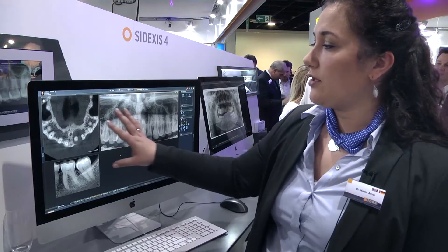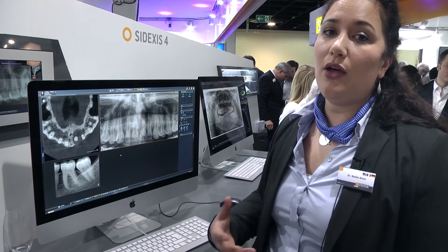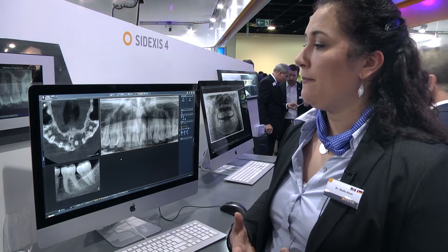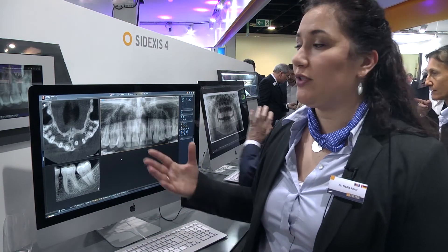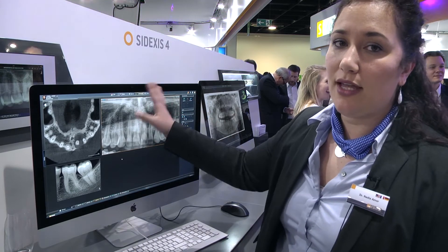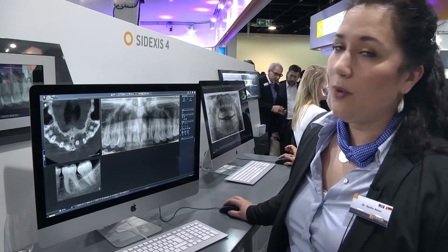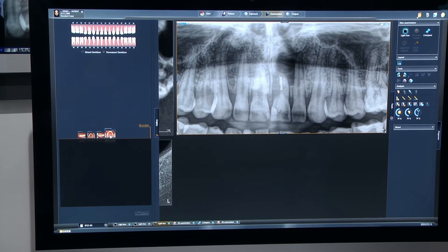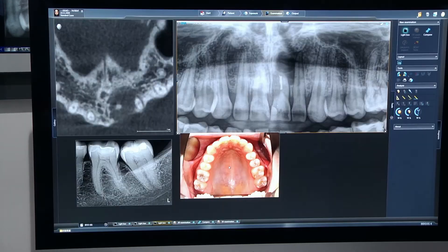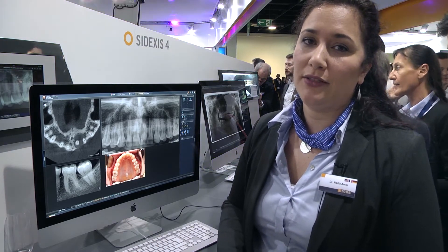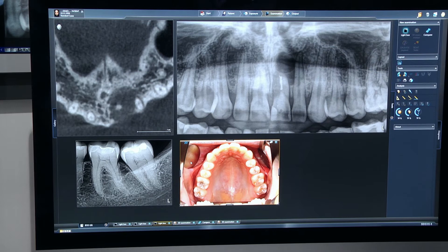After you've finished your diagnosis based on the X-ray images and you want to start explaining to the patient so they understand their current situation, you might want to use some of the photos you've seen in the timeline. It's very simple — no need to switch screens or go back to different phases. Just open the gallery on the left, you see the timeline again, scroll through, find your photos of interest, quickly drag and drop, and you can that easily add your photo to the screen and seamlessly continue in your patient communication. This is the 2D/3D compare in our lightbox.